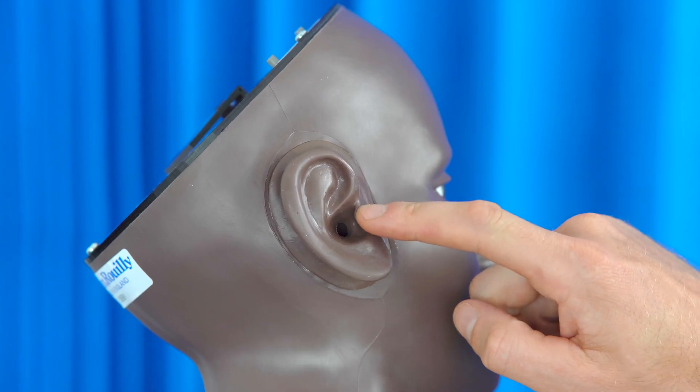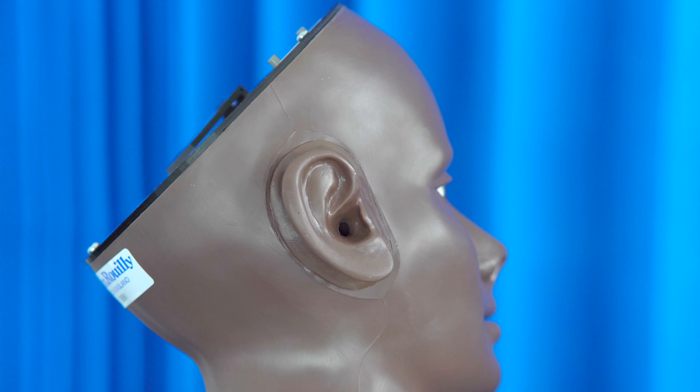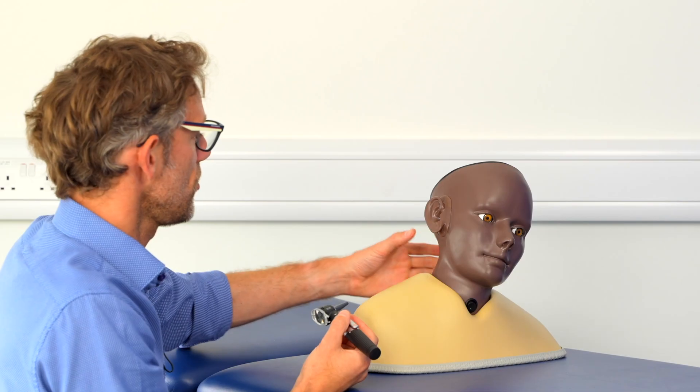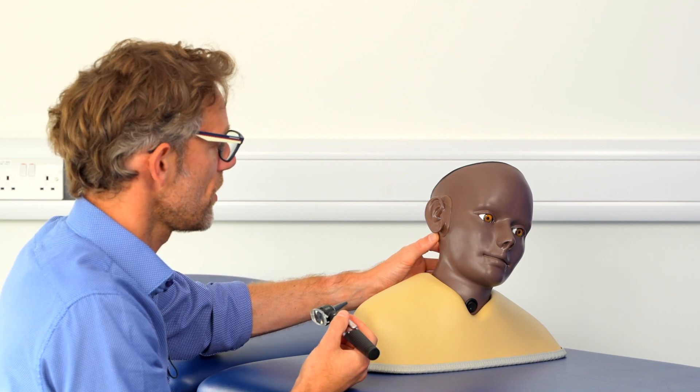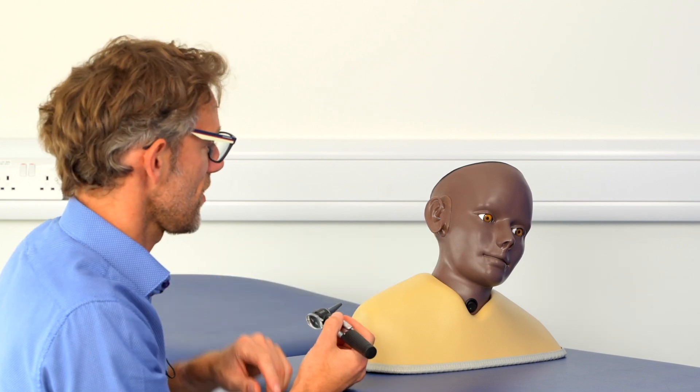I'm just going to press over the tragus, any problems there? I'm going to pull the pinna, any issues with that? Super. And I'm just going to press over the mastoid, is there any pain there? Fantastic, thank you.